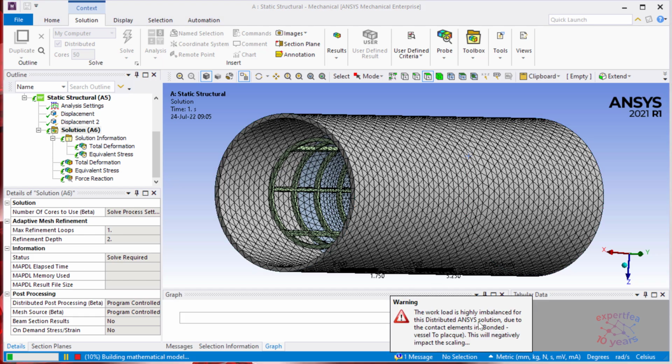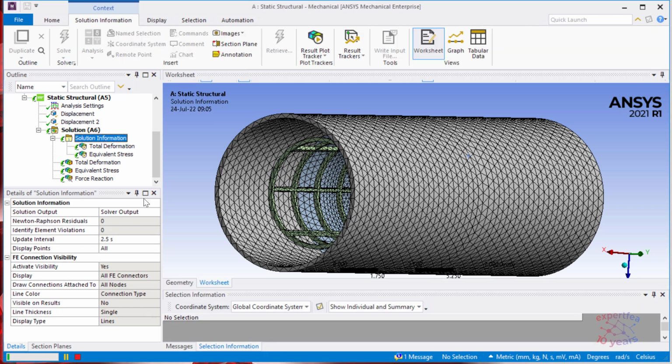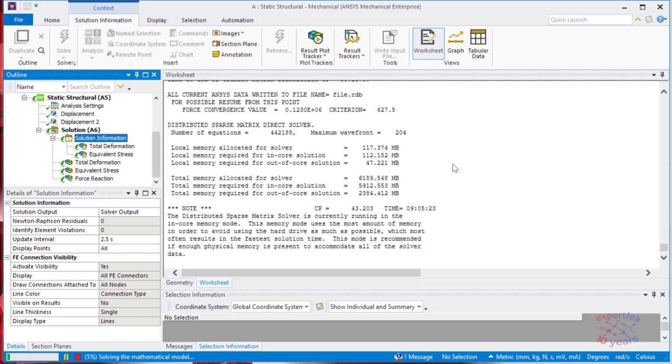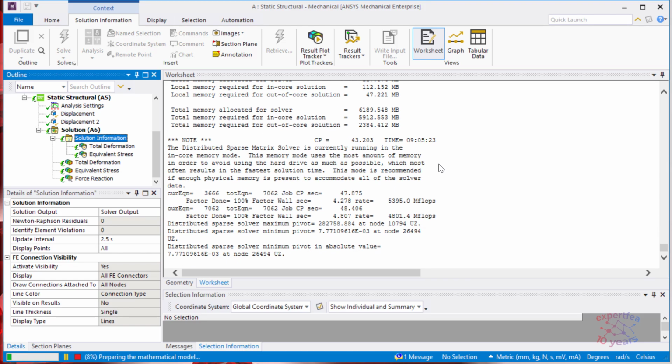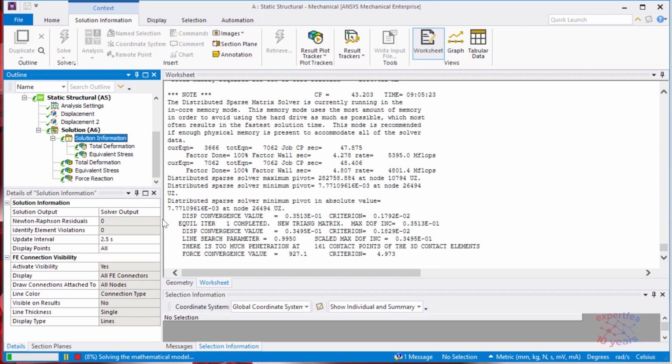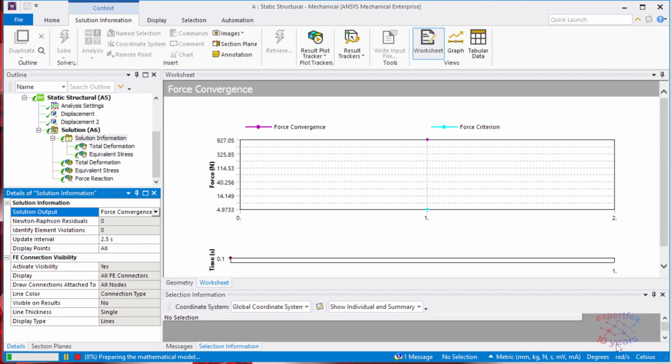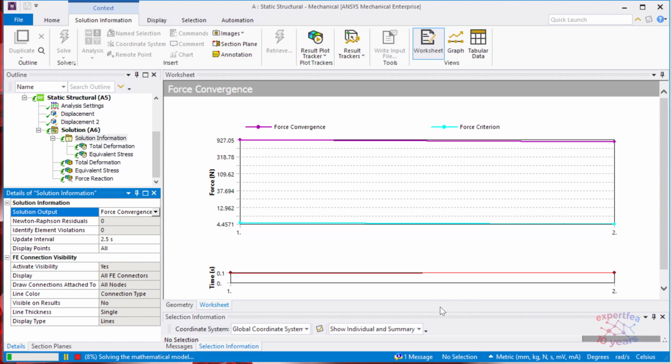So when we get such a warning, this means that the FEA started. Looking on the solver output, we see some initial, let's say, log and details. We're interested in the force convergence plot. Let's see how it works.